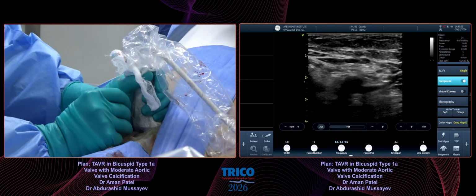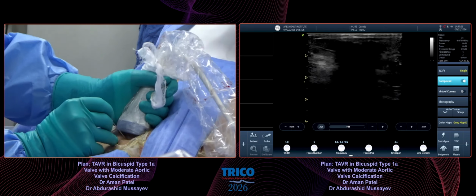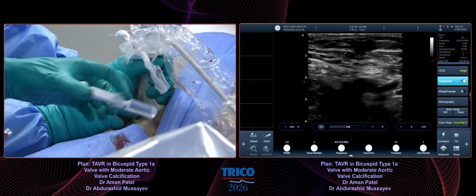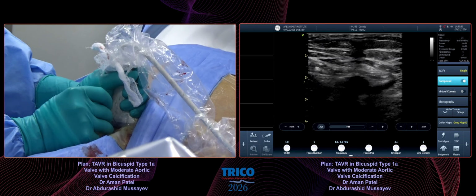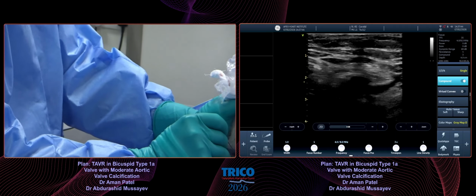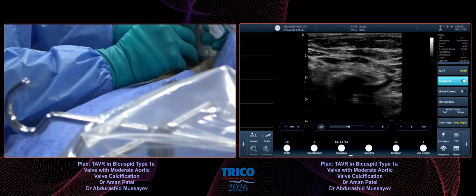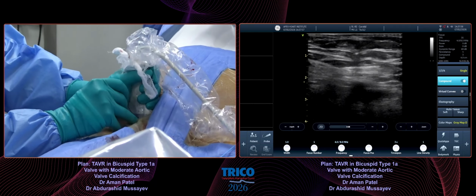Usually we are doing direct puncture with a regular needle. It is safe, and it also saves time. Yeah, but micropuncture is much safer, isn't it? Yes, micropuncture is also much safer, but both of them, as I mentioned before, are up to your hospital protocol. In this kind of case, a lot of planning has already happened.